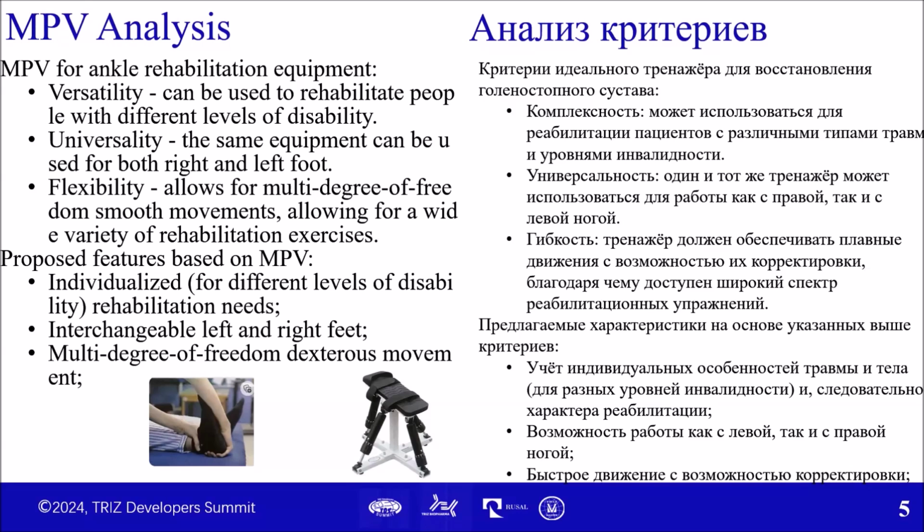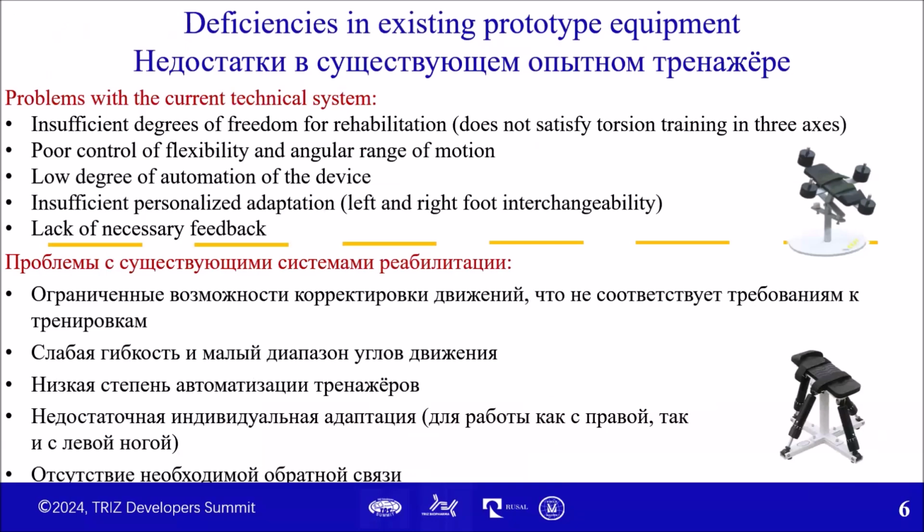The last one is flexibility, which means all the multi-degree of freedom movements allowing for a variety or rate of rehabilitation exercise. Problems with the current technical system.